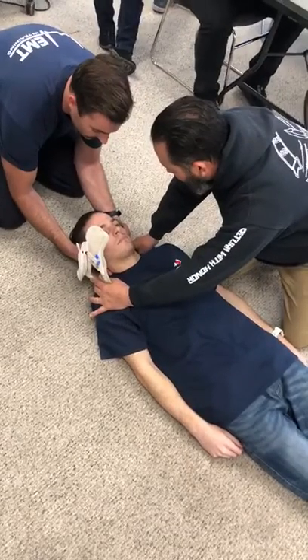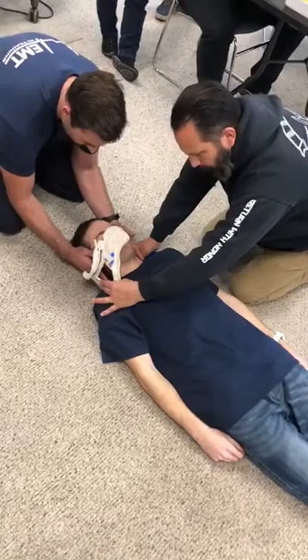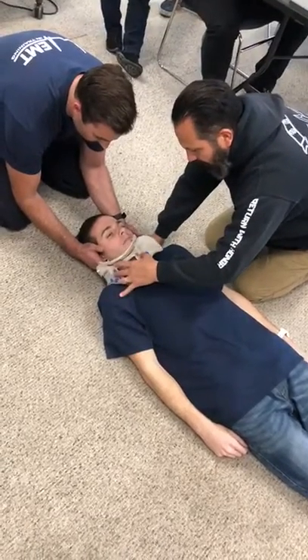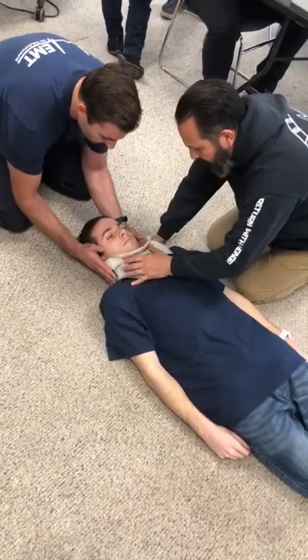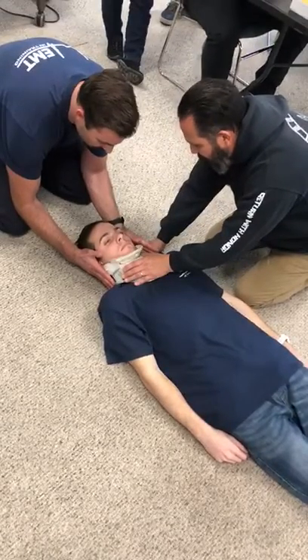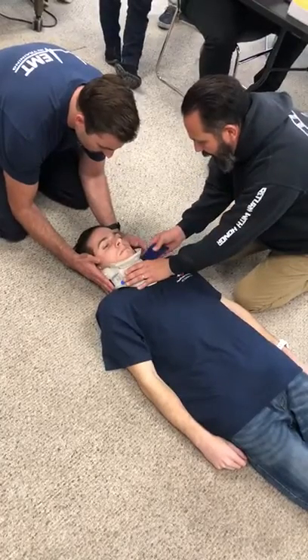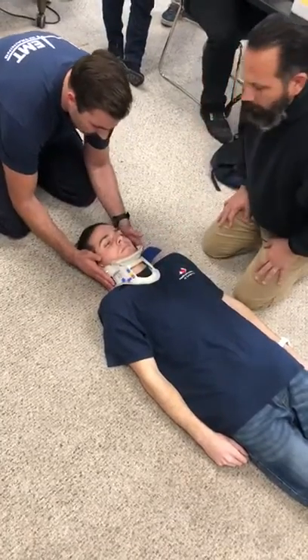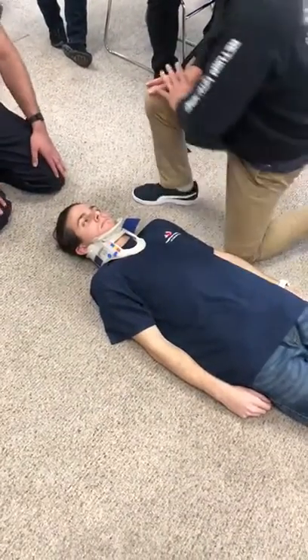Go ahead and lower on your three. One, two, three. He's lowered the head and is still holding c-spine. Now I'm bringing the collar over — he just has to adjust his hands around the collar. I'm holding here, adjusting his head, and now we hold it in place and secure the collar.